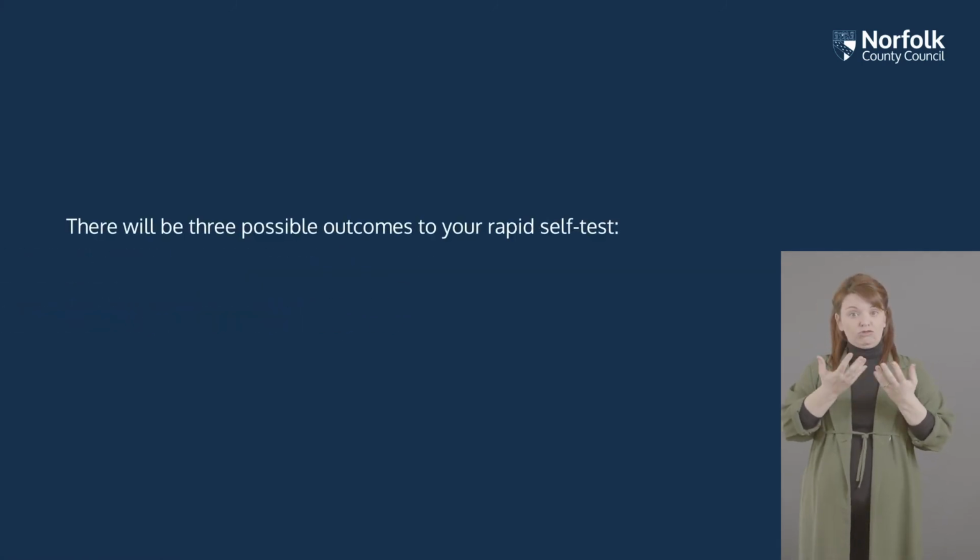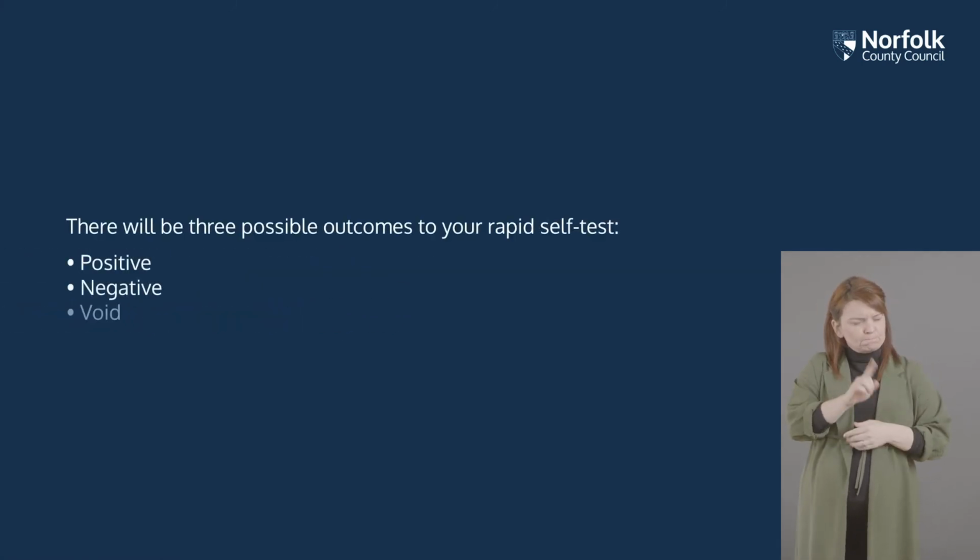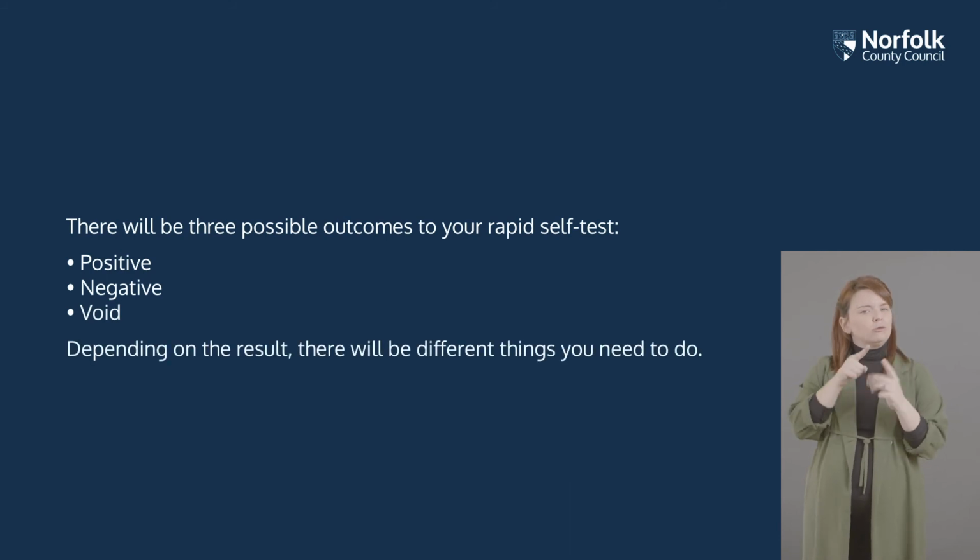What do the different test results mean? There will be 3 possible outcomes to your rapid self-test: positive, negative, or void. Depending on the result, there will be different things you need to do.